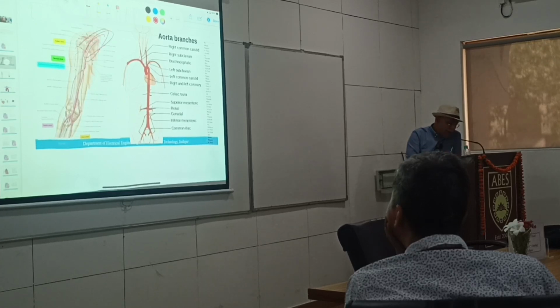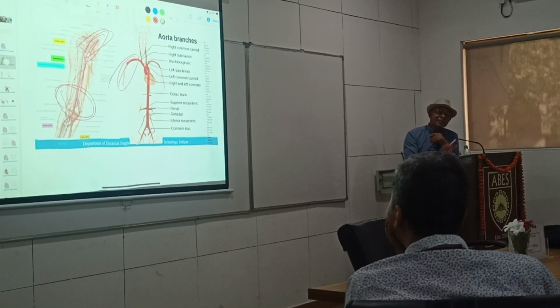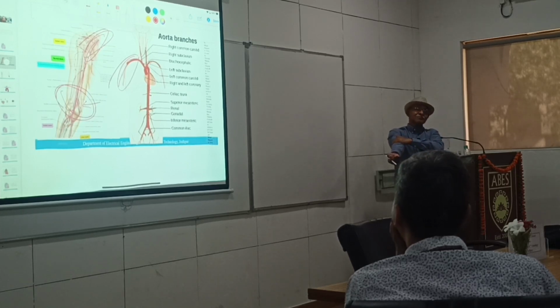That this line, if you see, and this line, they are connected through the aorta. This branch is coming, and this cuff is put here. So actually, blood pressure is measured here, right? And it is estimated or calibrated that if the blood pressure shown here is, suppose, 110 over 70, possibly here at the source the blood pressure is a little higher. So when this calibration is done, it is called an estimation of the blood pressure of the aorta from the cuff wrapped here.